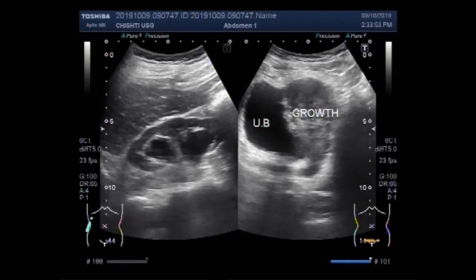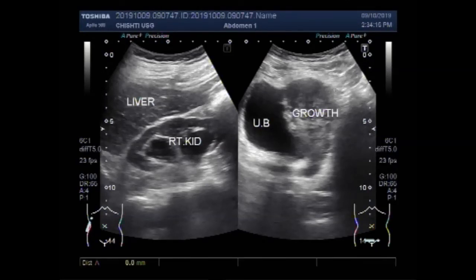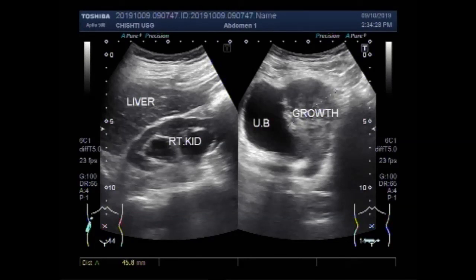This mass is semi-solid to solid in consistency and has heterogeneous echo density. The mass is seen attached to the right lateral wall of the urine-filled urinary bladder and the right side of the base of the urinary bladder. The mass measures approximately 4.7 cm x 5.9 cm.